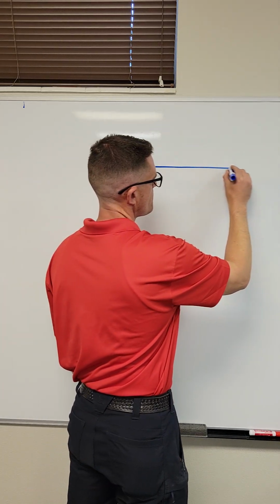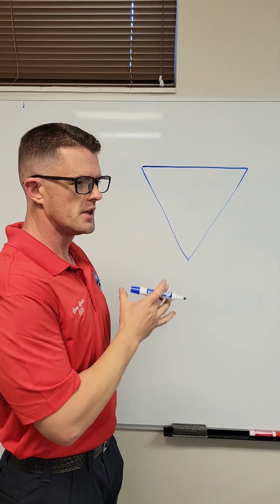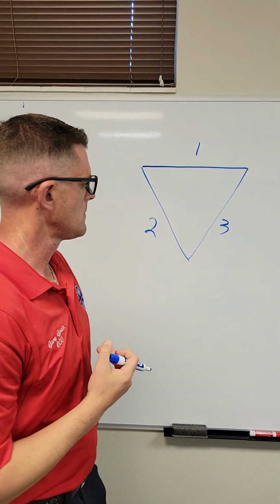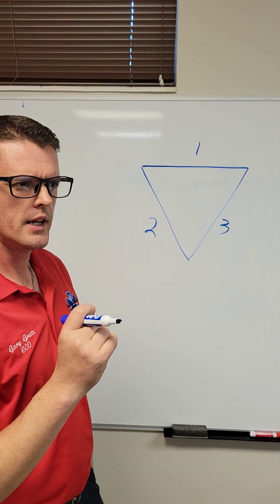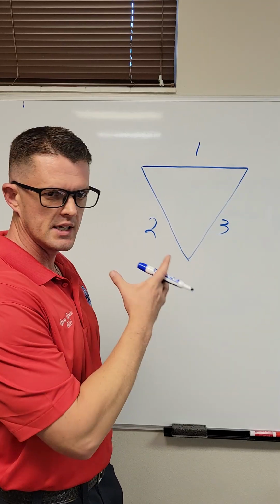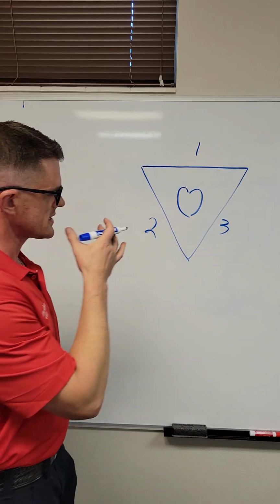So essentially, one of my biggest issues with a lot of these medic books is that they throw this picture up there and then they label it, right? And you look at that and you're like, 132, that's kind of weird. But one thing that I really don't like about it is that when you relate this to cardiology, right? Because essentially we're looking at a two-dimensional picture of the heart. And when you look at it, you go, okay, well, hold on a second.